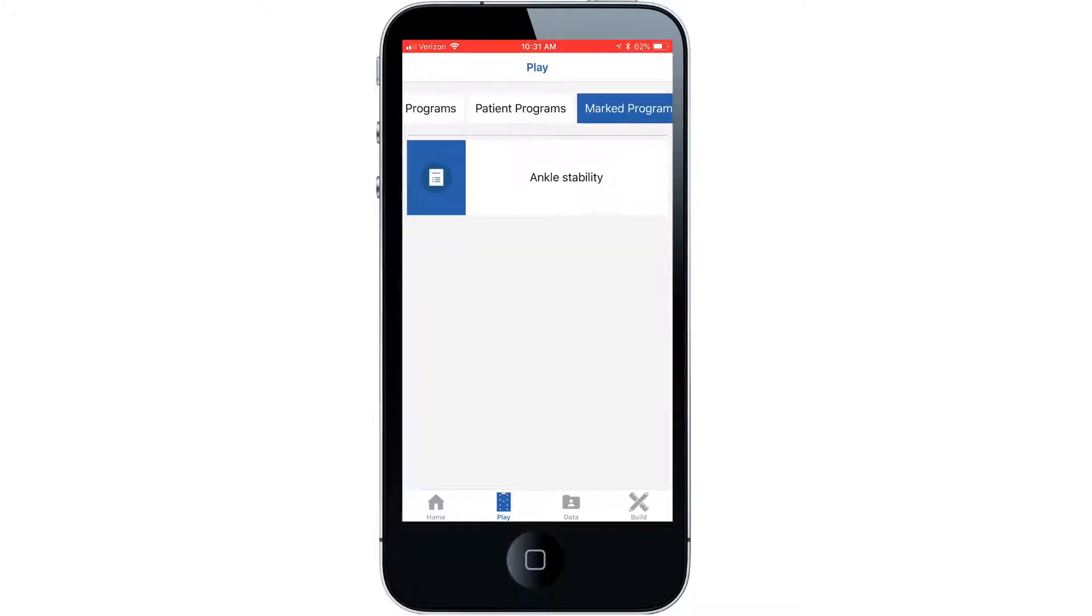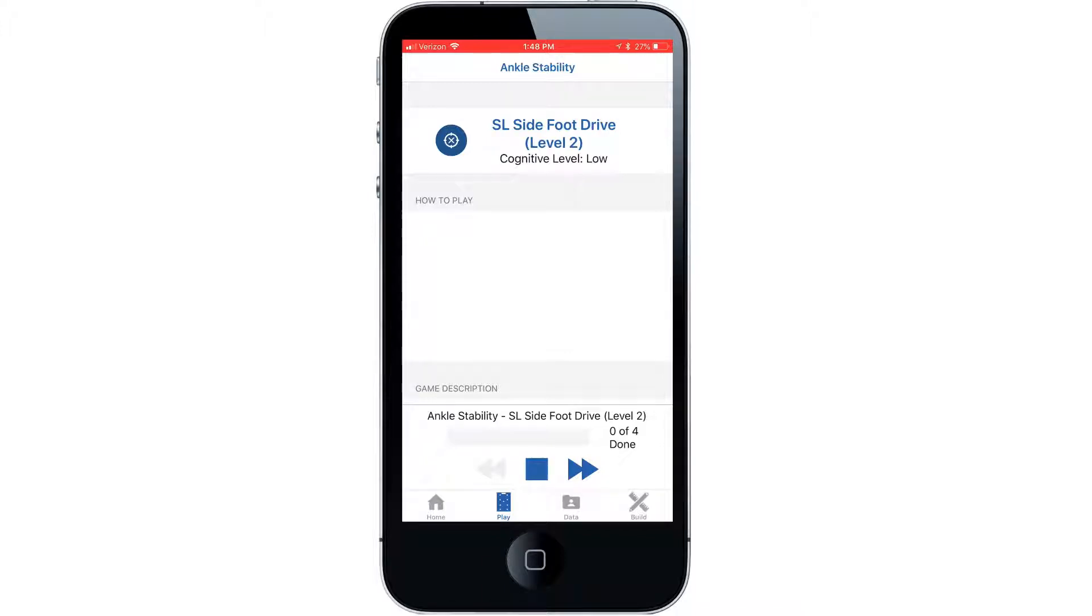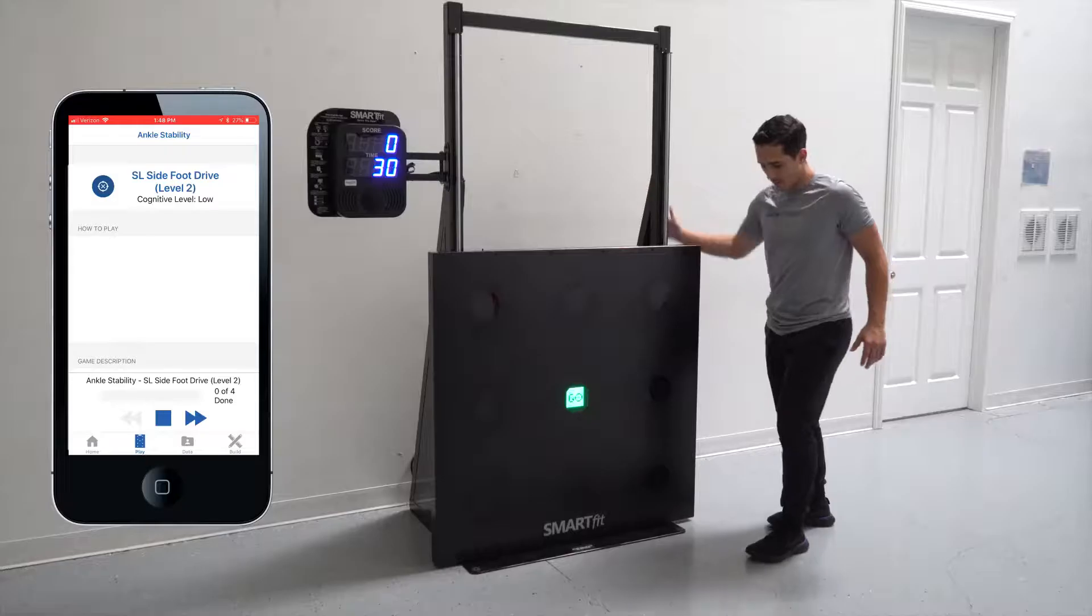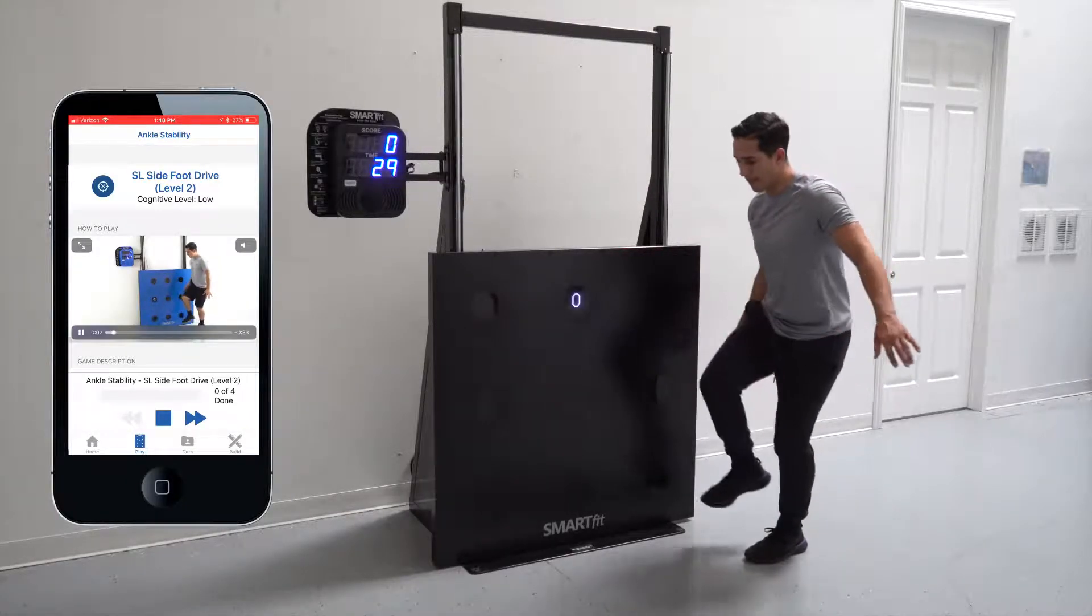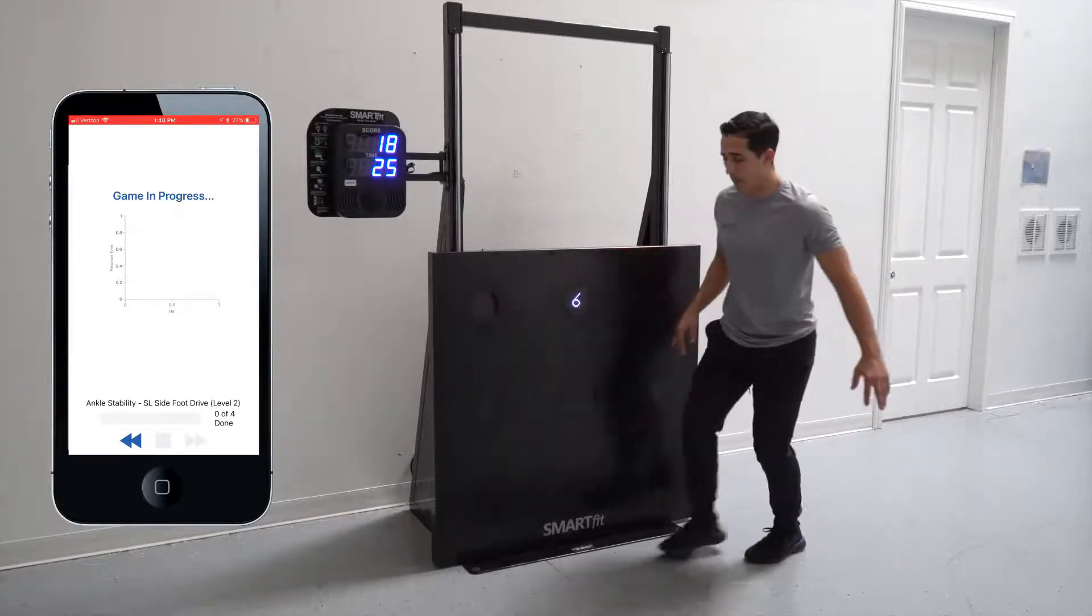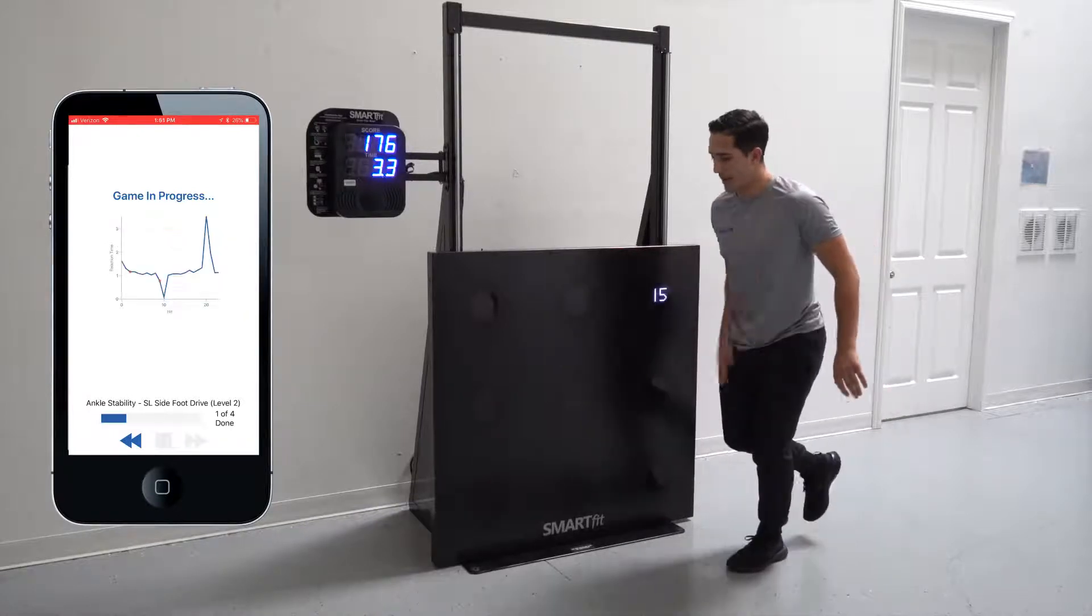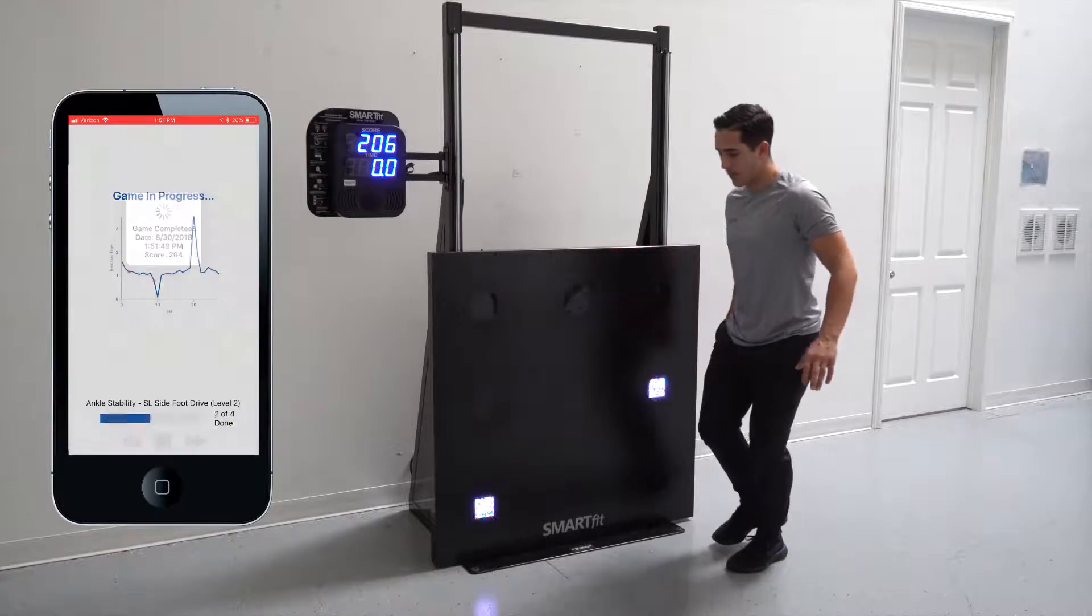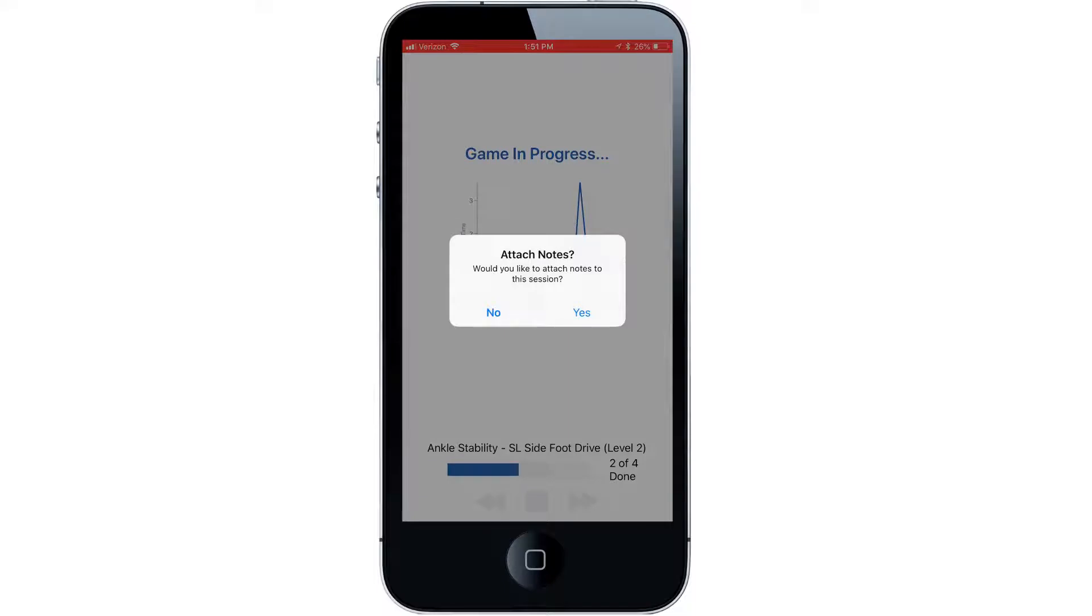Select the program and you will notice your selected activity list. You are ready to go as soon as you select the play button. Since the first exercise was selected from pre-designed activities a video will run showing you how to perform the exercise. The activity will begin as soon as the first target is activated. Choose whether you'd like to add subjective comments.